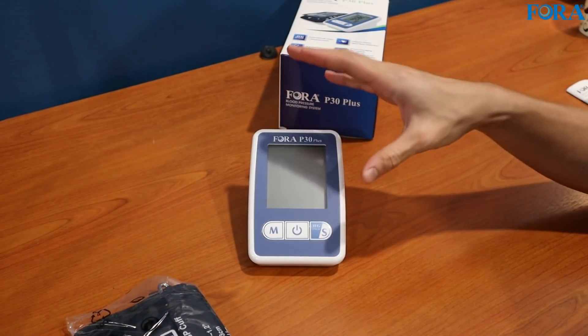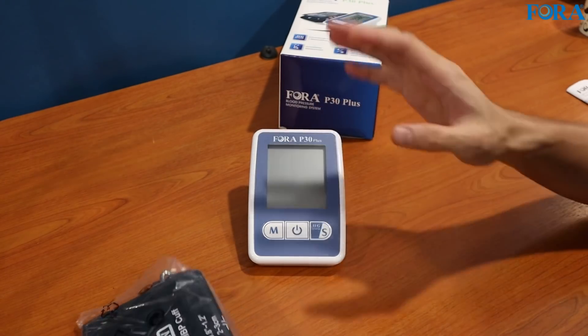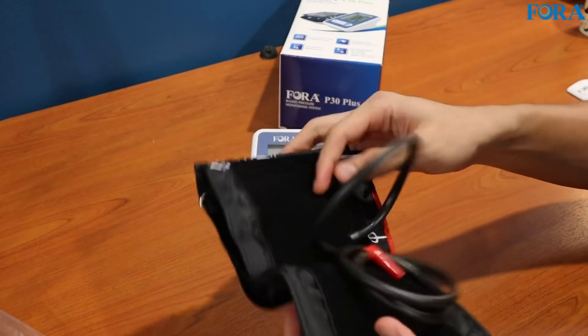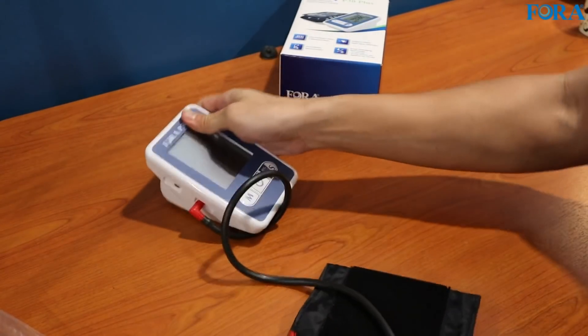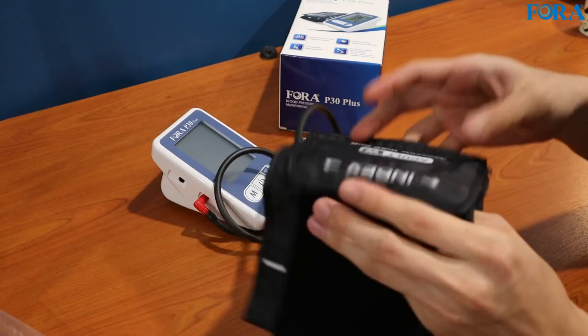I've done the setup for the date, time, and year on the device. It's very simple using the manual. Now let's have a look at the cuff. Feels very nice — make sure it's snug. And I guess we might as well take a measurement right now.